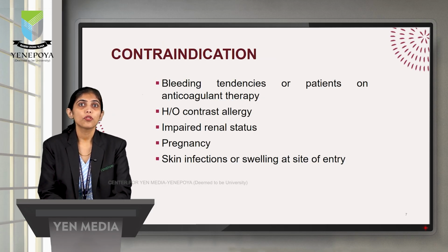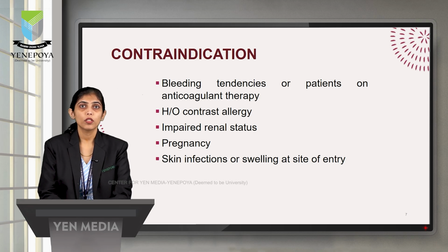Coming to the contraindications of the procedure, the first one we have is bleeding tendency or the patients on anticoagulant therapy, history of any contrast allergy, impaired renal status, pregnancy, skin infection or swelling at the site of entry.